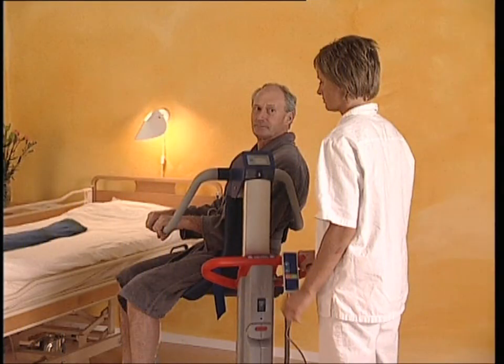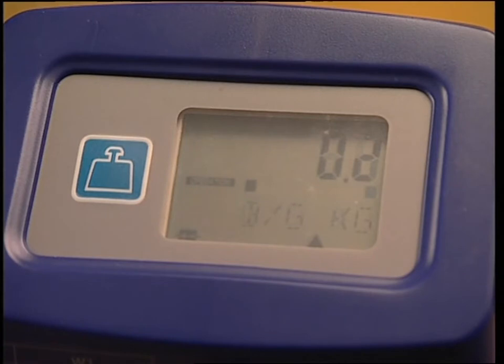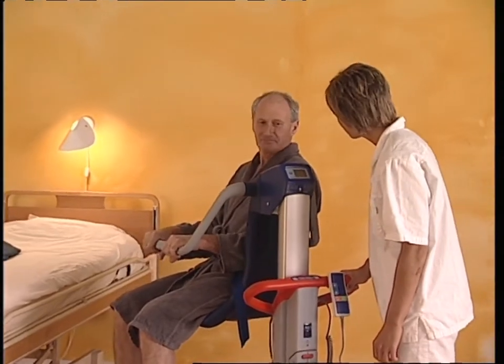And secondly, the resident is already sitting on the chair and the scale is not powered. Push the button. A display test is performed. All segments are shown for about one second. If any figures are shown on the display, push the button again. The display will then show 00 net mode.